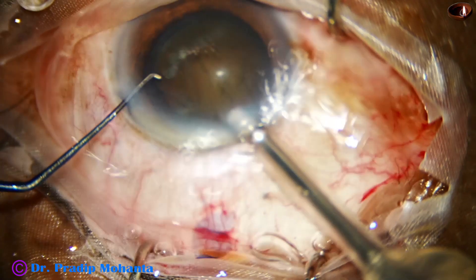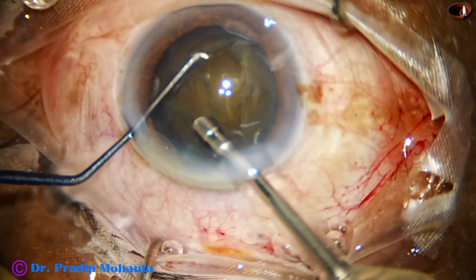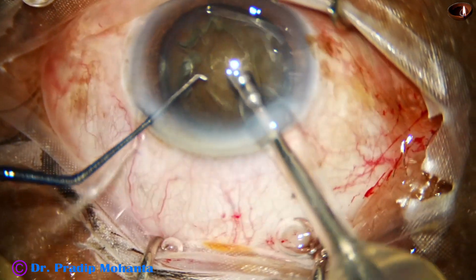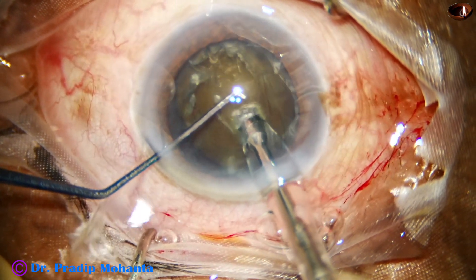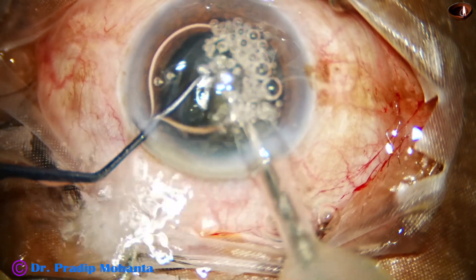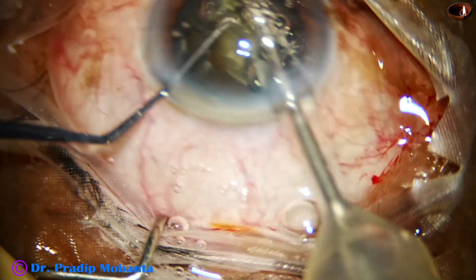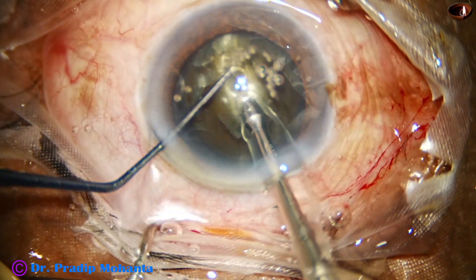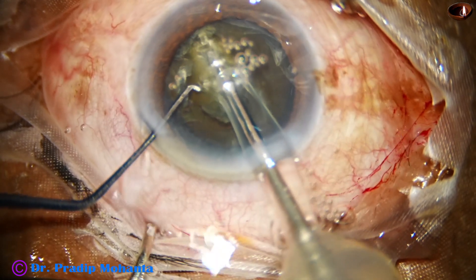And now, here goes the phaco needle with its bevel down. Some superficial lens matter, cortex and epinucleus is removed. And now, see what happens — I am trying the submarine technique, and suddenly there are a lot of air bubbles. The smaller ones are cavitation bubbles and the large one just entered the AC from outside.